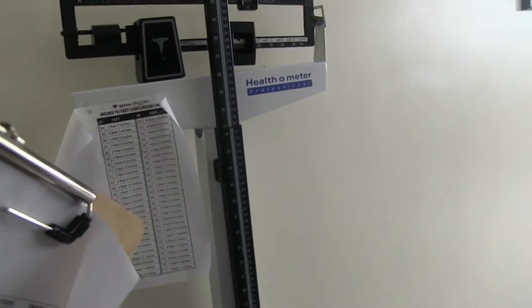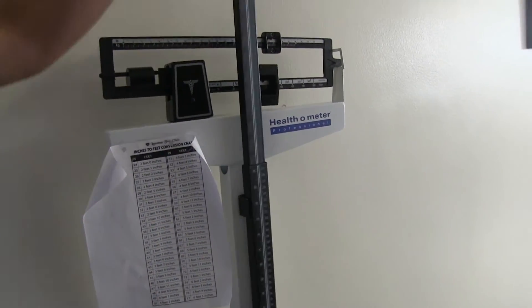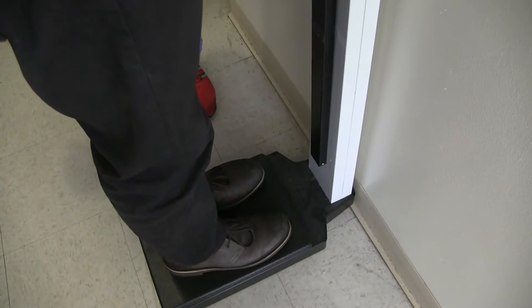For weight, we'll ask the patient to stand on the scale. Always make sure that their feet, both their feet, are in the middle of the plate.